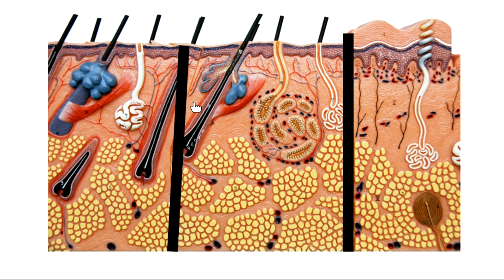So what you would see labeled in your lab packet, the middle section here says it's axillary skin. So with a D again, axillary skin is what that picture is labeled. The one over here on the right is labeled thick skin. And the one on the left is labeled thin skin, I believe. So you've got 3 different pictures in your packet. Yeah, so Jacqueline beat me to it. This axillary skin, this is the type of skin found in your armpit. The axillary region was the armpit region. One of my previous students said the way she liked to remember that is, yeah, Axe body spray.